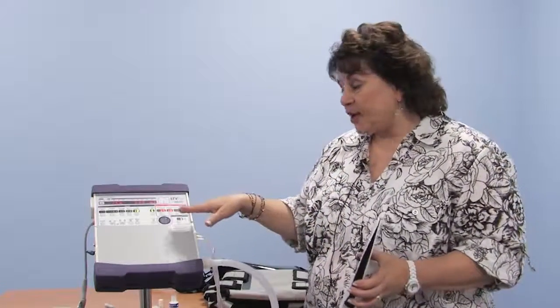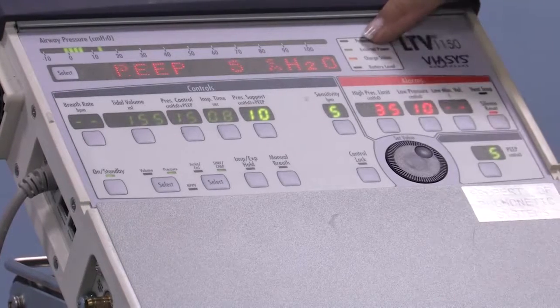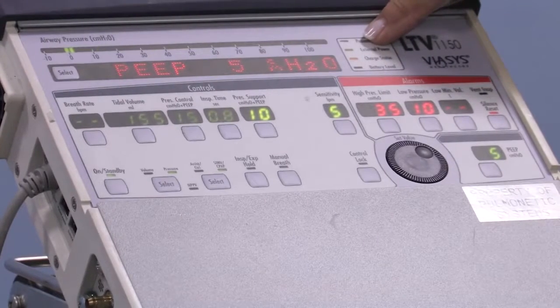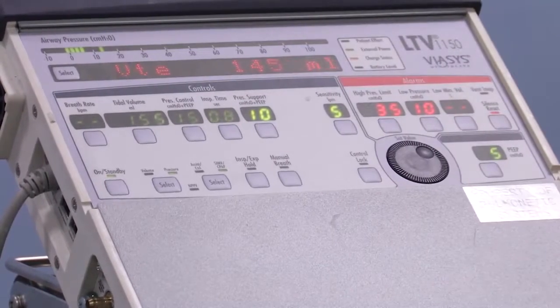If your child is on a mode of ventilation in which they are responsible to take every breath, like pressure support, otherwise known as BiPAP, there needs to be a way in which the machine can respond if they stop breathing. The way the LTV vent does that is we set an apnea, or cessation of breathing, delay time. So I can set 10 to 60 seconds. If your child doesn't initiate a breath and isn't seen triggering a breath, like I am doing right now with the ventilator, it will go into backup ventilation.